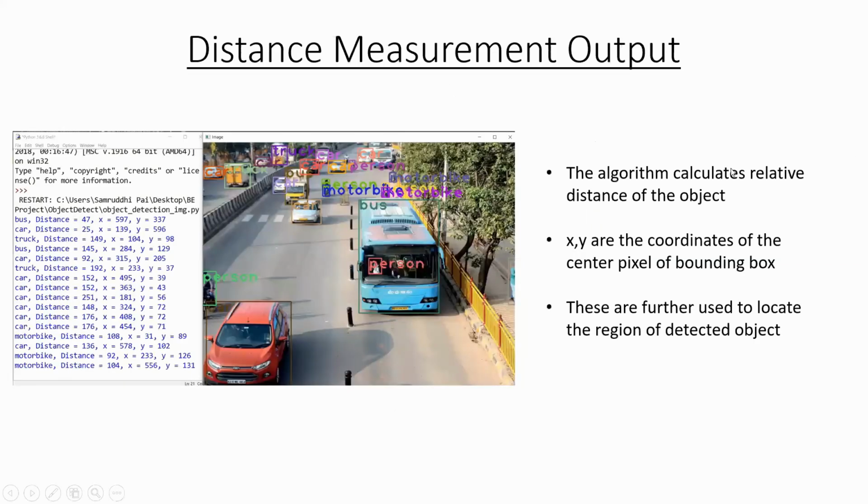The next task was to locate the position of the object with respect to the person. Considering the person to be standing on the central axis, we divided the entire image into three parts: center, right, and left. Whichever object is detected, we calculate the distance, and for the object that has relatively minimum distance from the person, its location is identified based on where it lies, whether it is in front of the person or towards right or left, and the audio output for the same is given.